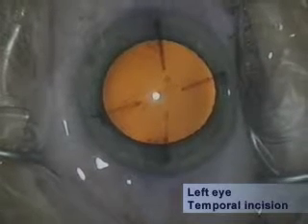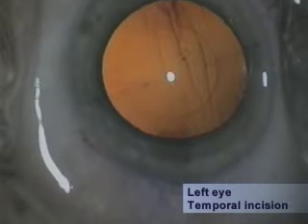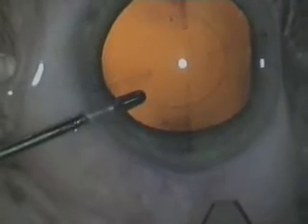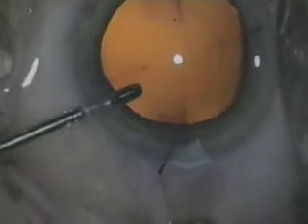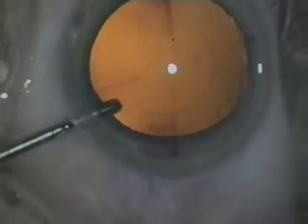The circular capsulorhexis must not exceed 6 mm to ensure a complete overlap of the optic. For the implantation of the microcyl toric, a 3.5 mm incision is required.